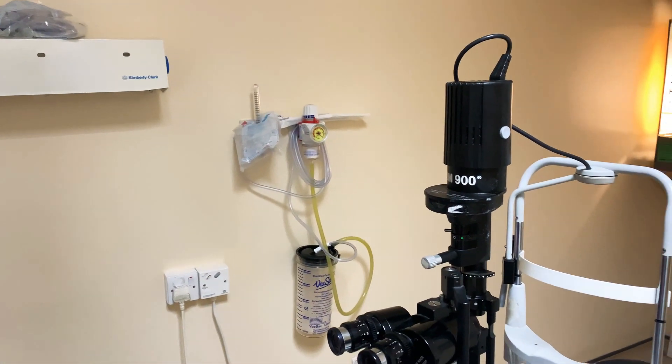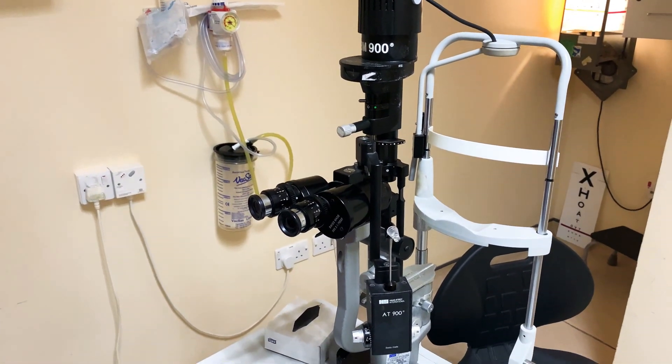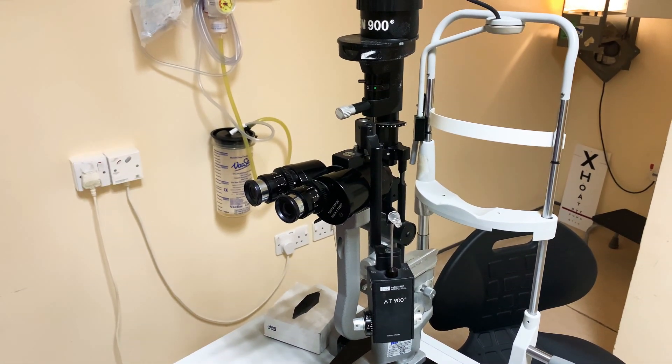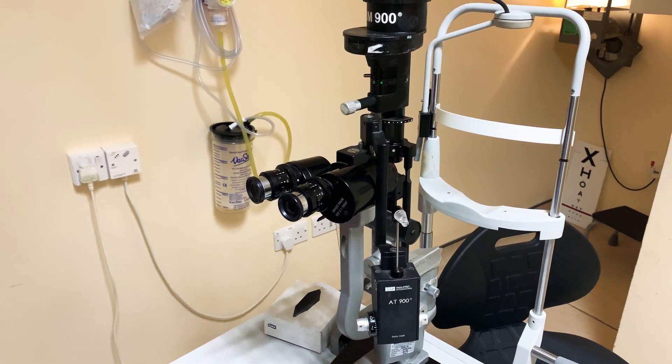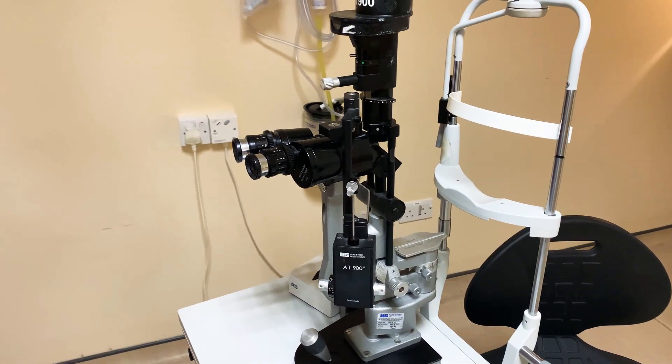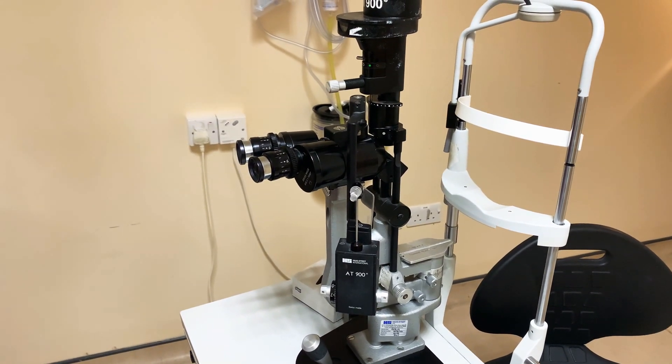So just to start off, the slit lamp is actually a very difficult piece of equipment to use and it takes a long time to master it. There are some nuances, but really the best thing you can do is just have a go, practice, play with it until you get familiar.